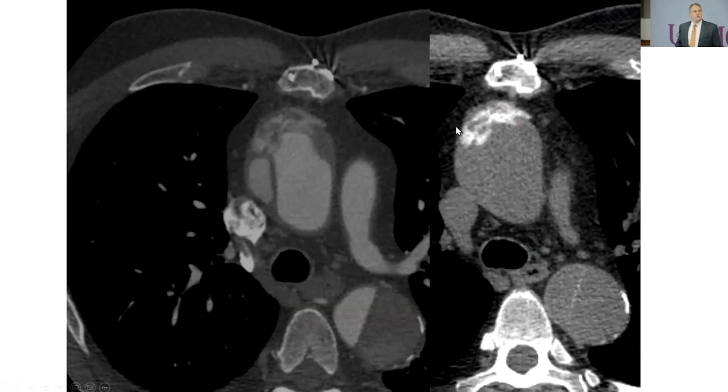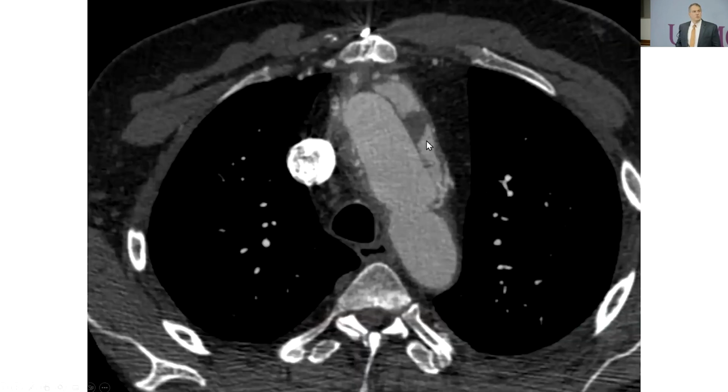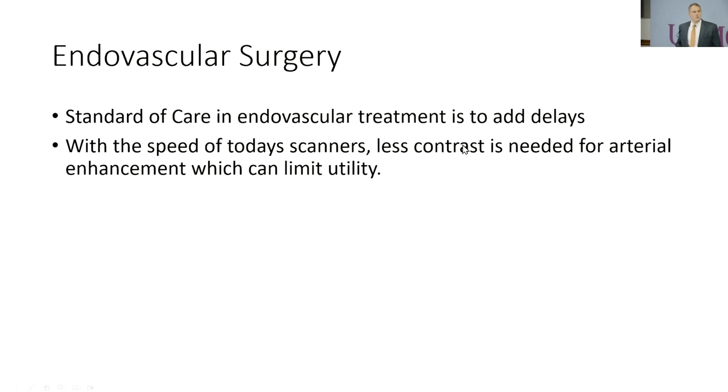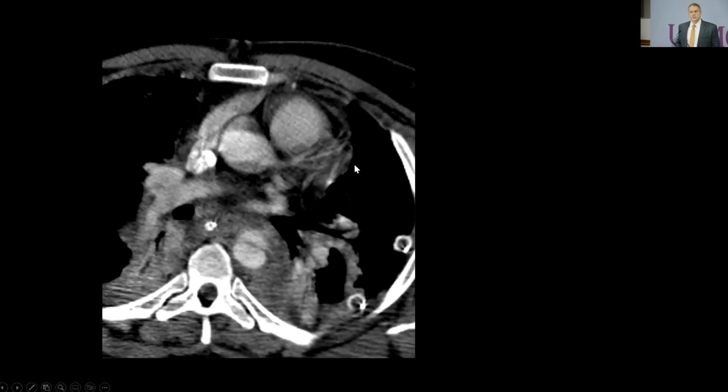When you look at the non-contrast scan, you can compare and be fairly sure that you're having surgical material. This is a case that had a more complex post-surgical condition, and it looks like there are little pseudoaneurysms around and other things. In this case, those were all calcifications and surgical material. There was some contrast outside the lumen, but you can really use the non-contrast to help be more specific with interpretation and care.